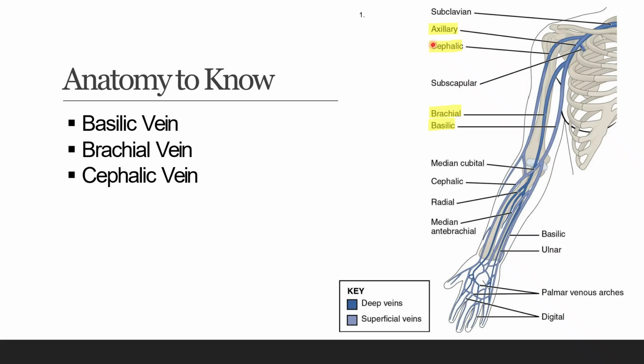First one below that is the cephalic vein. You'll see this in a lot of bodybuilders, and also in dialysis patients, but typically in those it's a bigger structure. It can be very small and hard to visualize. It's a nice straight vein, very superficial, and there's not any concerning structures around it beyond the biceps muscle. But because it's such a small size, or it can be absent in some individuals congenitally, this may be a difficult one to locate. It's not always an easy structure that you find.